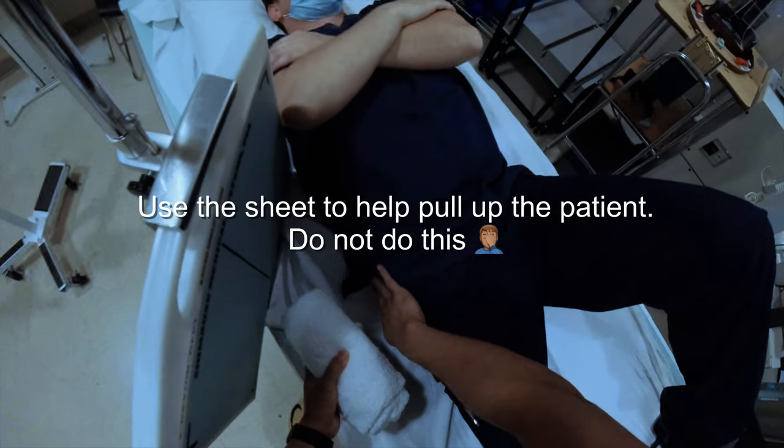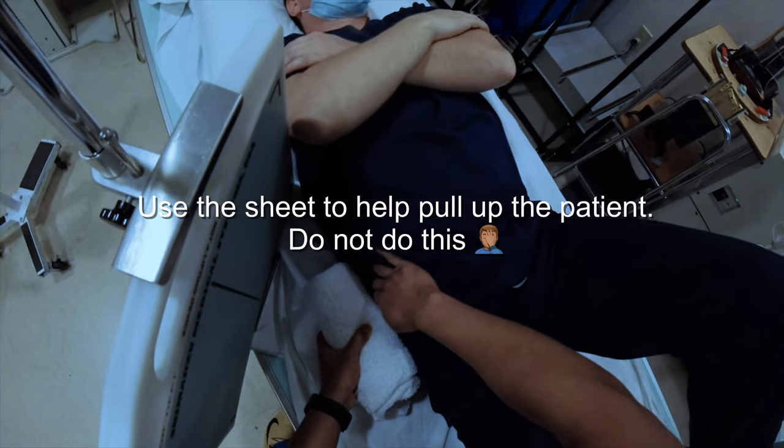Go ahead and rotate your hip up here, away from me, and then go ahead and relax.